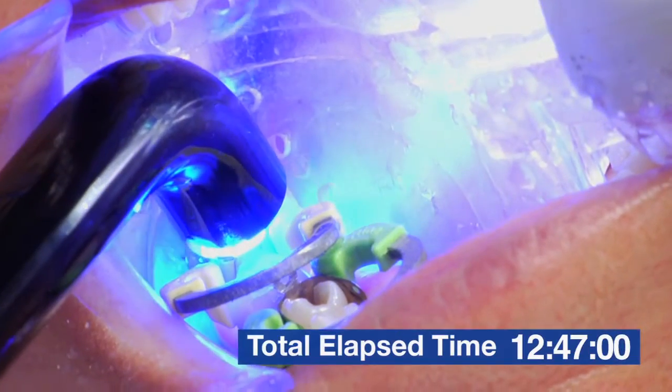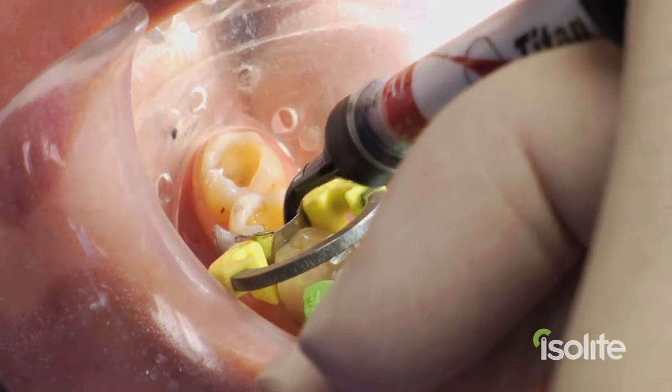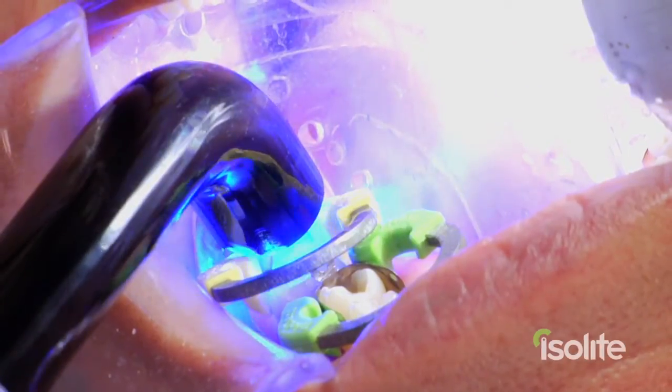We can also turn off the operatory light and the overhead light so that does not affect the composite set either. This gives us great visibility and a perfectly safe environment to do our composites.